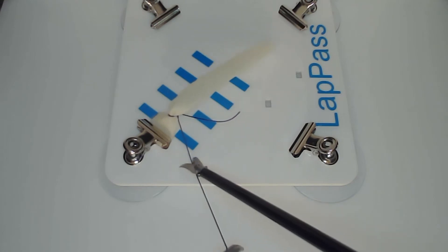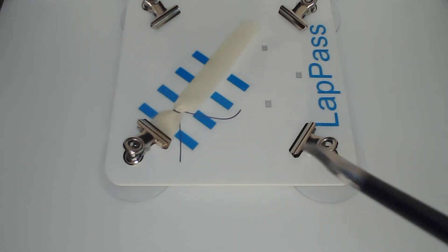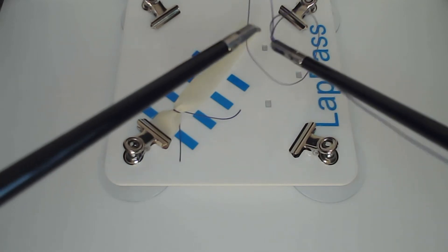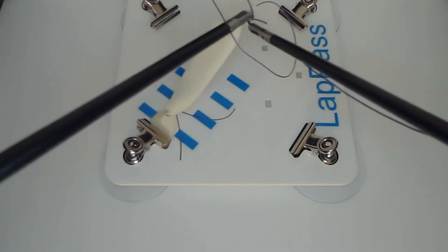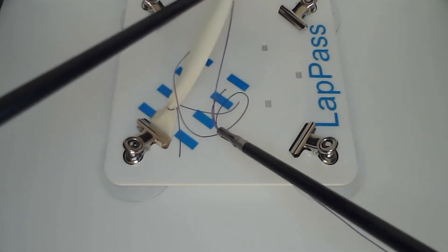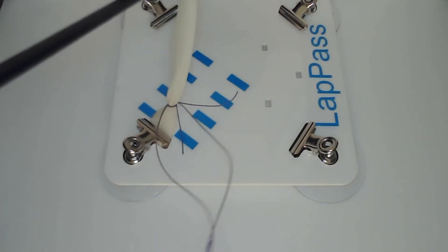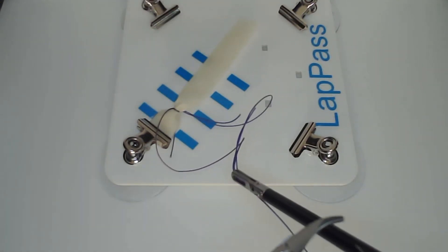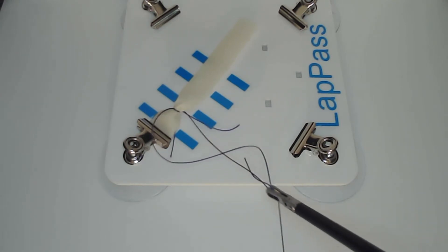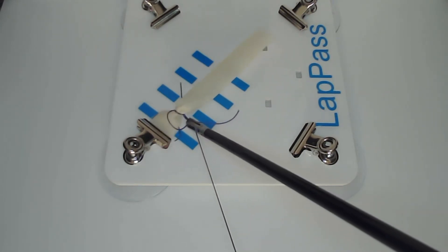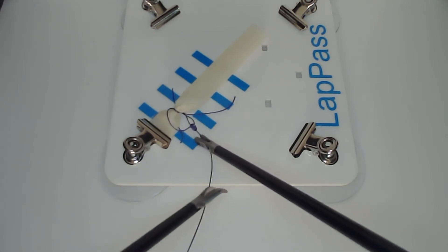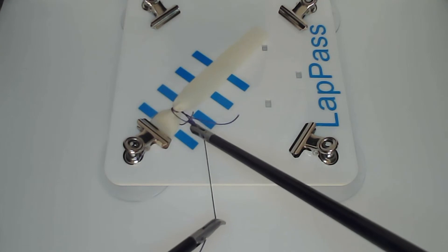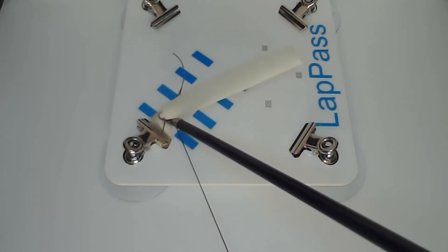The idea of the task is to place two extracorporeal sutures in the proximal zone, one extracorporeal suture in the distal zone, and then cut between the two in the middle zone. You fail the task if the knots are not secure and also if they're not in the appropriate zones. Each zone should be about a centimeter diameter.